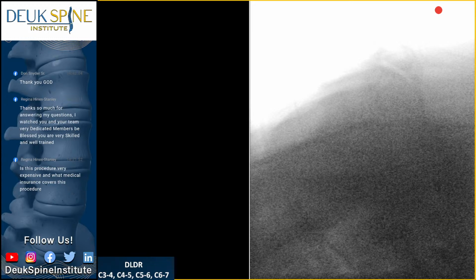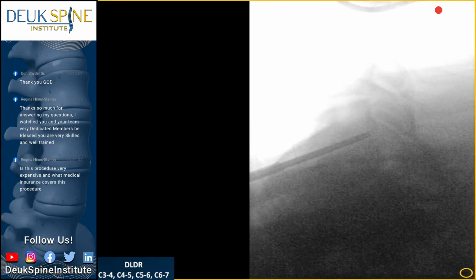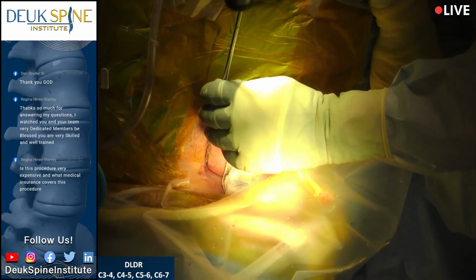All right, we will need some better visibility here. I need a shoulder pull inline traction, please, doctor. Yeah. Wow. That tube is anterior. Stay where you are, everybody. We're going to have to deliver this down.